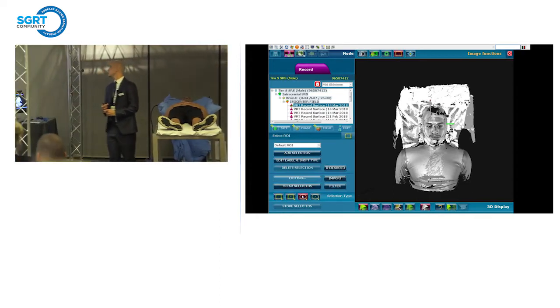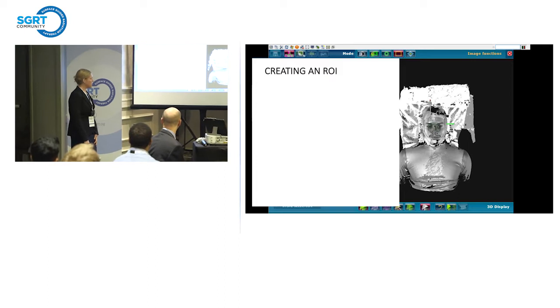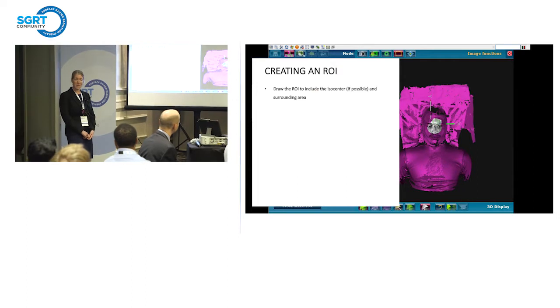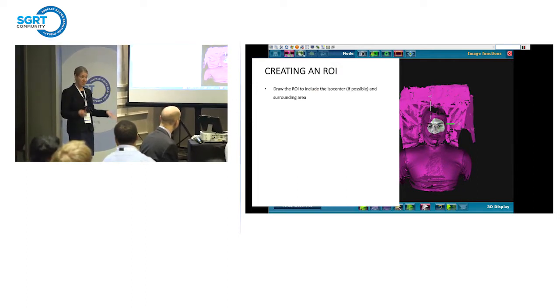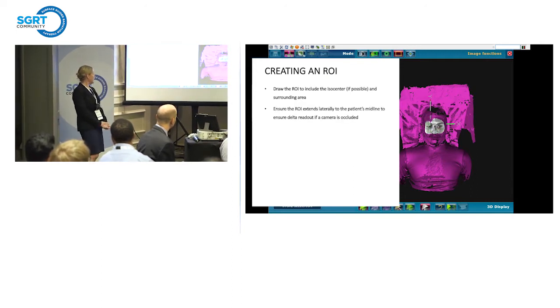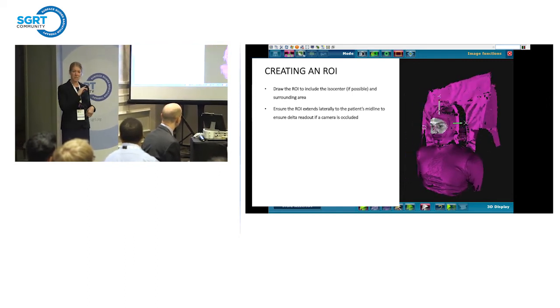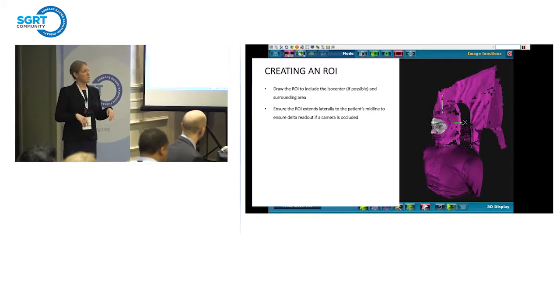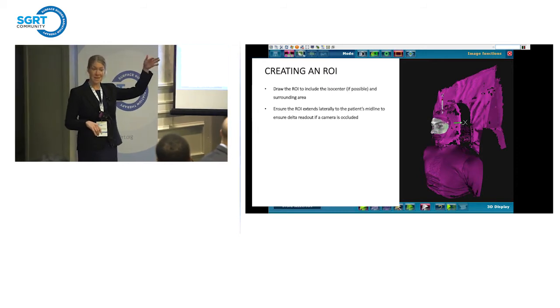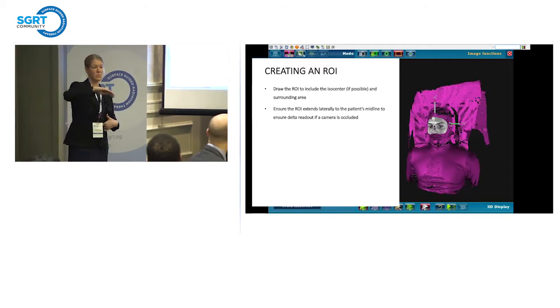Yeah, so we have some guidelines of how to draw your ROI and some tips and tricks of what to include, what not to include. For creating an ROI, you want to make sure that you draw the ROI to include the patient ISO center and also the surrounding areas right around your treatment area. Next, you want to make sure your ROI extends laterally to your patient midline or mid-depth, and that's just to help your continuous delta values when they're being monitored. So what we'll see is that when the gantry is going around the patient and blocking one of the OSMS cameras, you still have enough information on your patient and laterally that your deltas would be one continuous monitoring session.